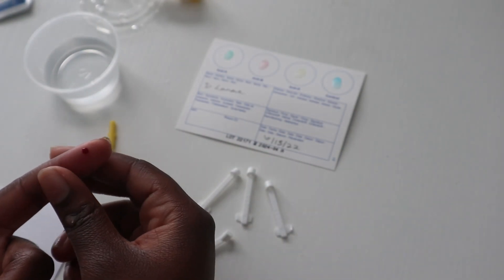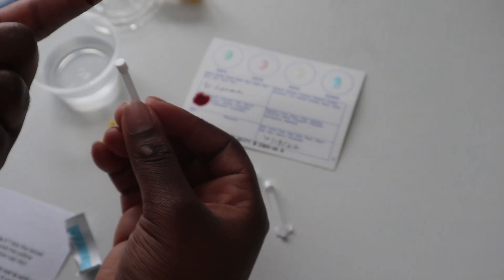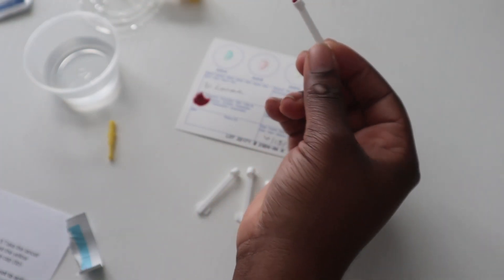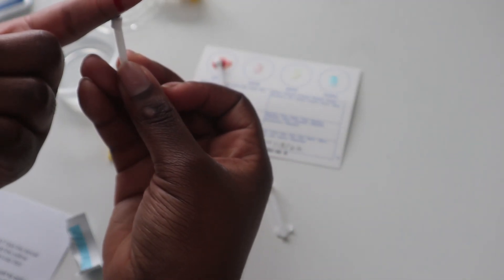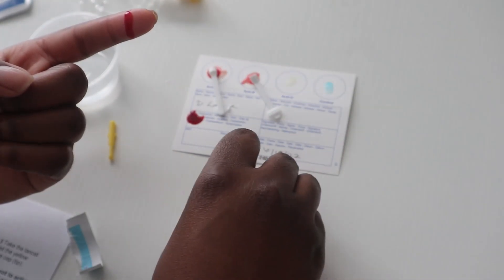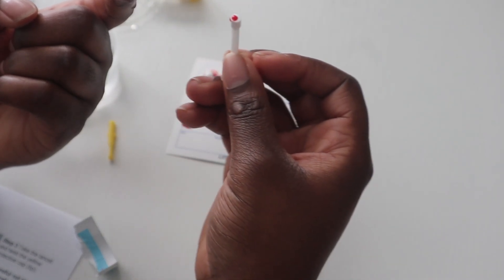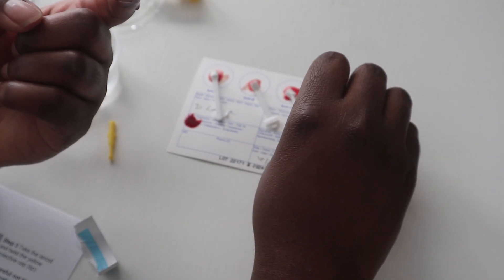Massage the finger to increase blood flow. My blood is going crazy! Time to let it fall onto the card. I'll put it onto the first circle — that's one, two, I have to be fast, three, and then lastly four. Done with these sticks now.